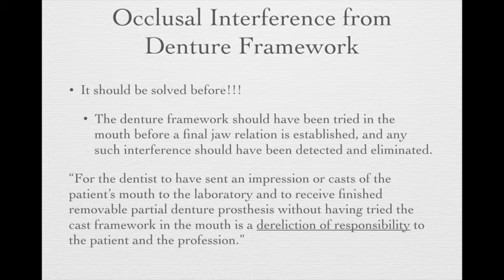Because remember, when we do a framework try-in, we not only check the fit of the framework to the natural dentition, we also need to see if the framework has any occlusal interference with the opposing natural teeth. If we see any occlusal interference from the framework, we should adjust it at the framework try-in. So if you do the procedure correctly, you don't necessarily need to do this at the denture delivery.